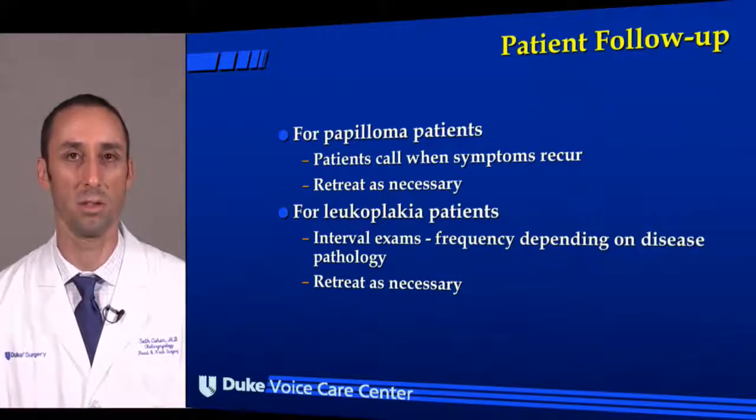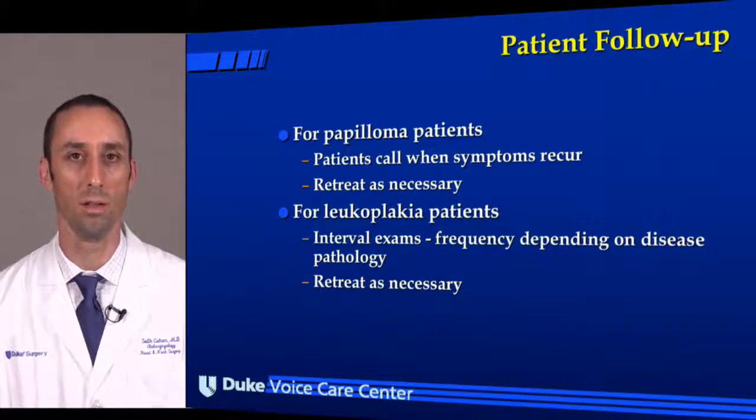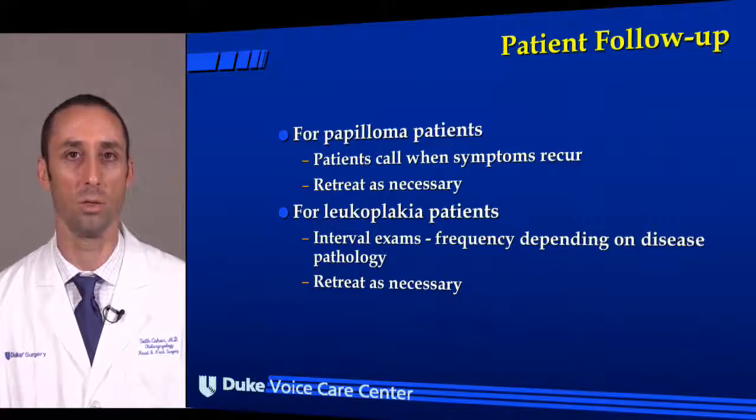So if they have disease that's returning, the threshold of when you treat depends on both the function of the patient and how the voice is doing, and the degree of the pathology. Again, mild dysplasia with a small recurrence, I might watch a few times and make sure that it's not getting worse. Severe dysplasia, because of the risk of malignant transformation, if they get a recurrence and it changes, they need something else done. And if it does not respond to an office laser procedure, then they need to go back to the operating room for a complete excision using the microflap excision technique.